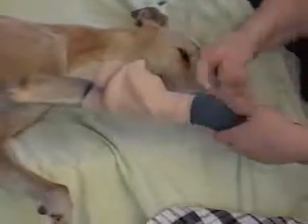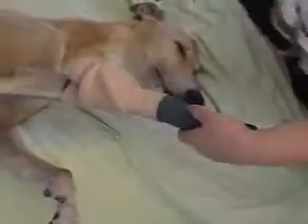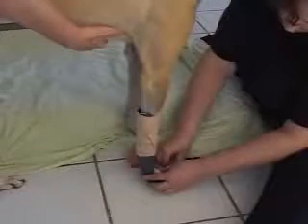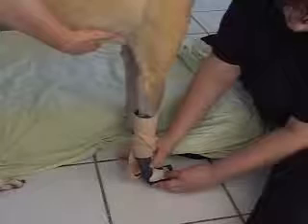Since this is a functional splint to assist with mobility, it's best to form the foot portion of the splint with the animal in standing. If this is a large animal, you may require some assistance to help the animal stand up. While the animal is standing, use your hands to mold the distal part of the splint around the foot.